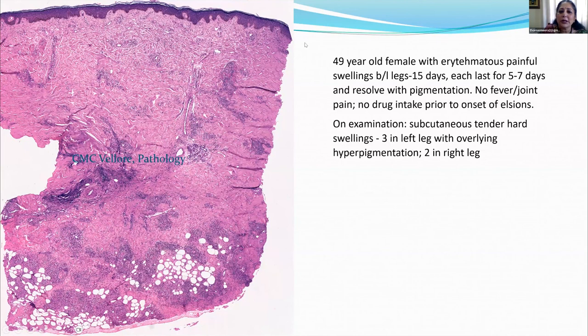Okay, I'm seeing one answer. Septal. Okay. So we've got 2 people telling me it's septal. 3 septal. So here is the panniculus. This is the panniculus. You can see the septa here. So is it septal or lobular?